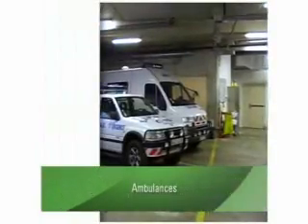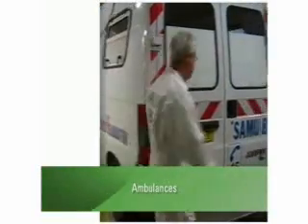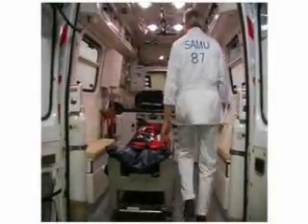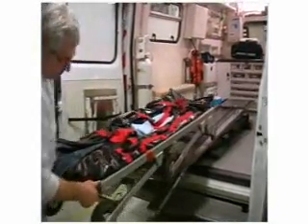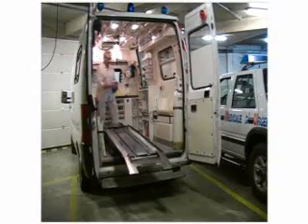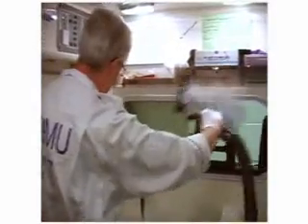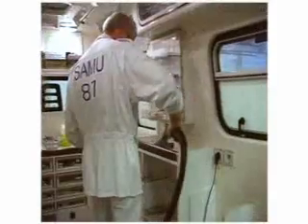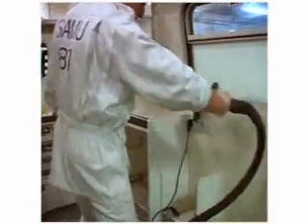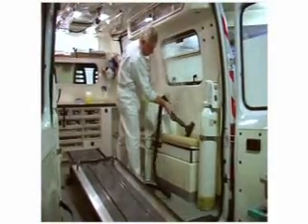Although there have been no epidemiological studies so far on the infections transmitted during transport in an ambulance, the cleaning and sanitization of these vehicles is indispensable to prevent such an eventuality. The vehicle is first stripped of all its equipment before the cleaning process. The cleaning procedure is hampered by the lack of space and the presence of the fixed devices. All the vertical and horizontal surfaces are nonetheless steam cleaned.